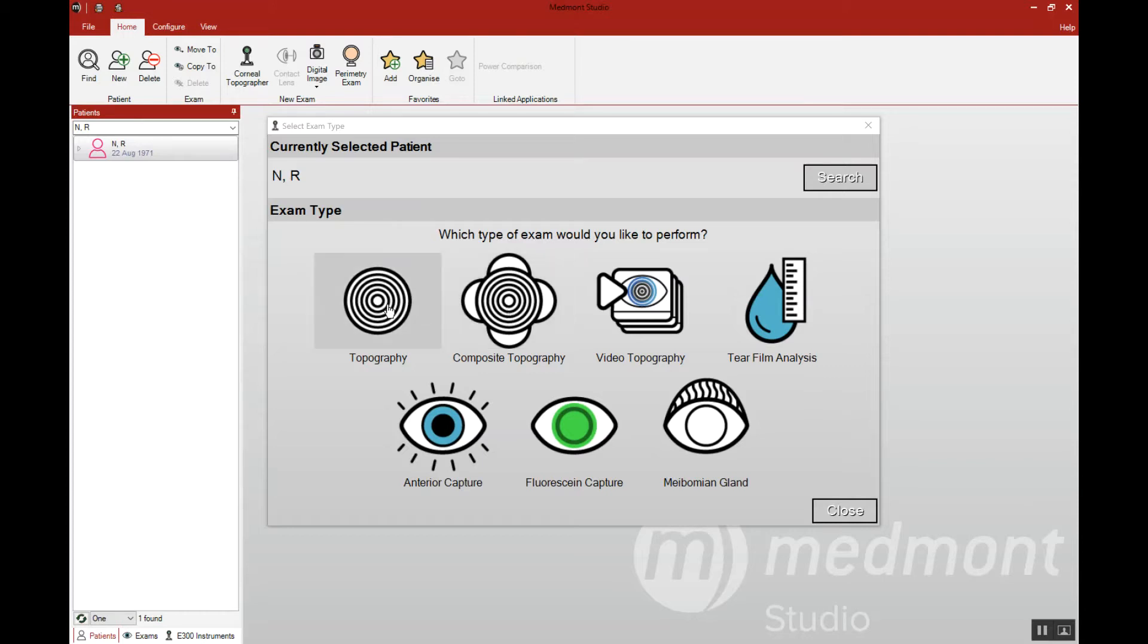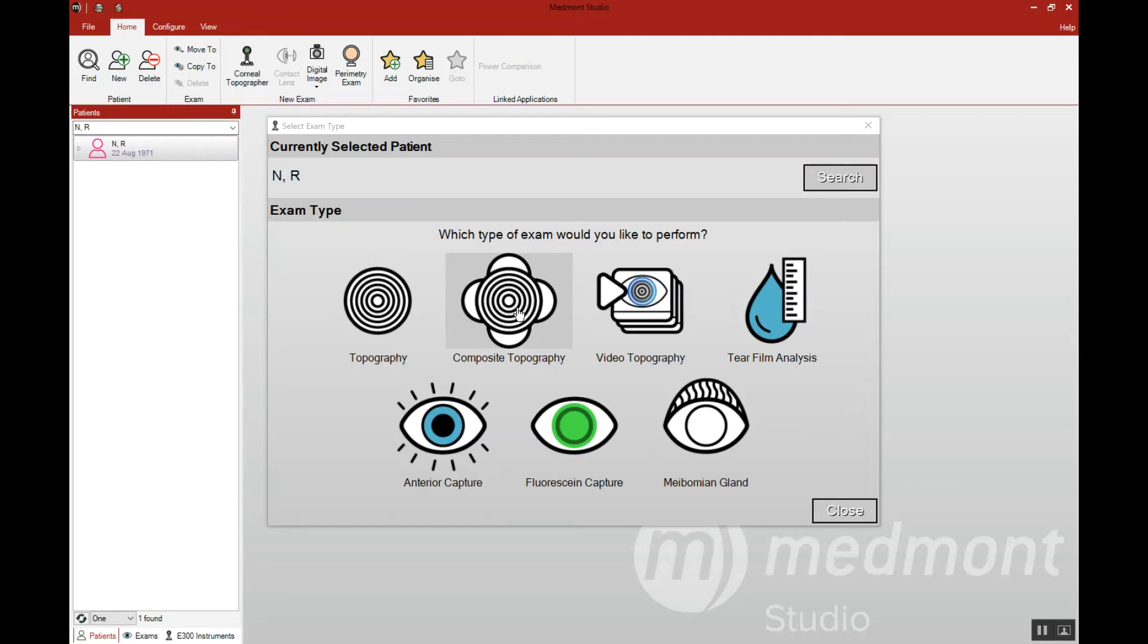A single topography capture is useful when you need a simple screening of what is the general eye shape. Is it regular? Is it irregular? Is it normal? Is it diseased? But a composite topography is very useful when you're building a specialty contact lens such as an orthokeratology lens or pretty much any corneal GP or scleral lens. Related to the contact lens software, the composite topography is really valuable to you.